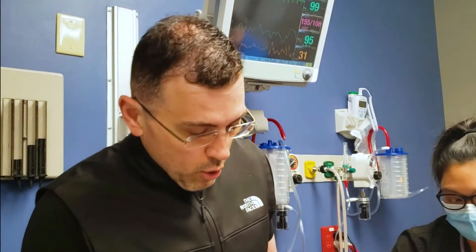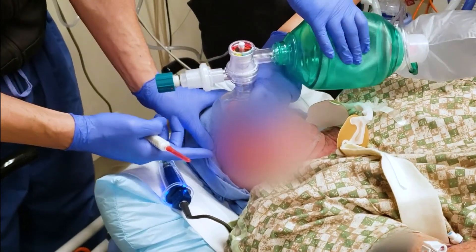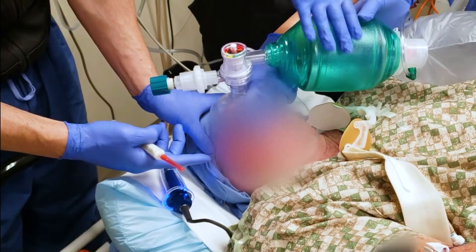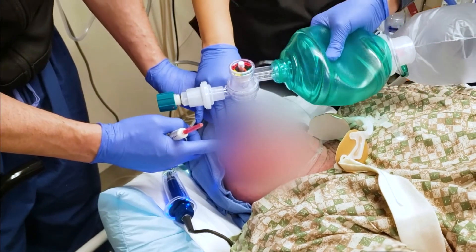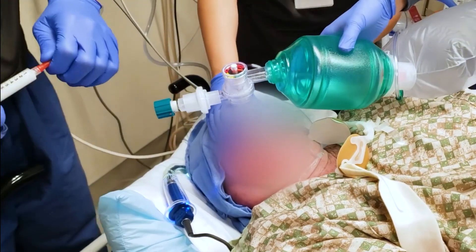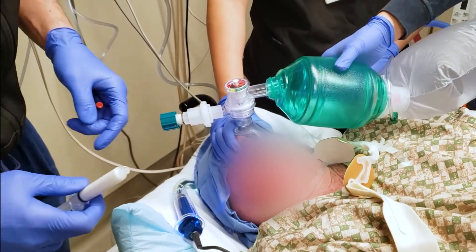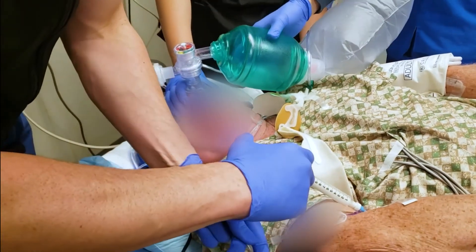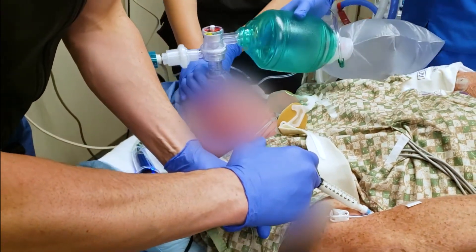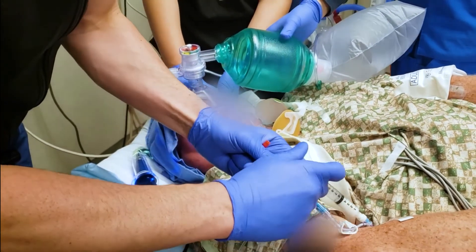Here we're going to demonstrate how to use the GlideScope. The patient has a nasal cannula, which will help maintain oxygenation during intubation. We're bag masking right now. For induction medications, I'm going to use propofol and ketamine — a nice combination. The ketamine helps reduce the hypotension from the propofol, and with the propofol you get really nice laryngeal muscle relaxation.